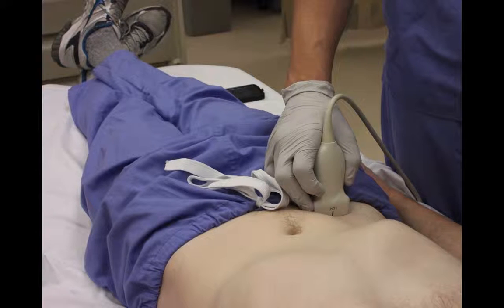I'll put the probe where it hurts and I'll move up and down a couple of centimeters and see if I can see an appendix there. Another trick that can be useful is to have the patient place their right leg over the left leg. This theoretically can bring the appendix a little closer to the anterior abdominal wall.